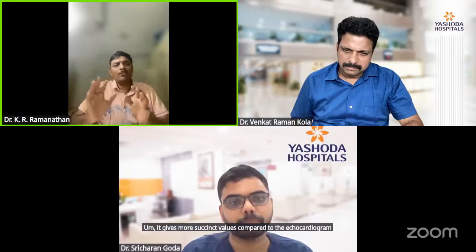Some of the values on echocardiogram might be useful. One of them would be aortic VTI.